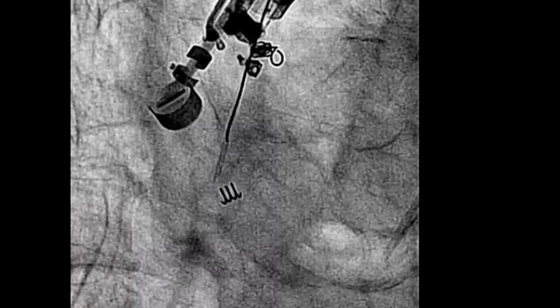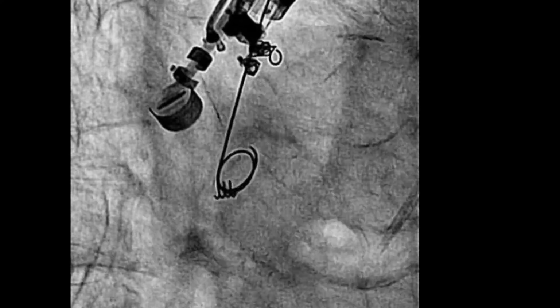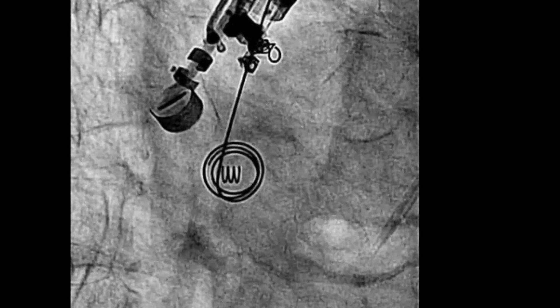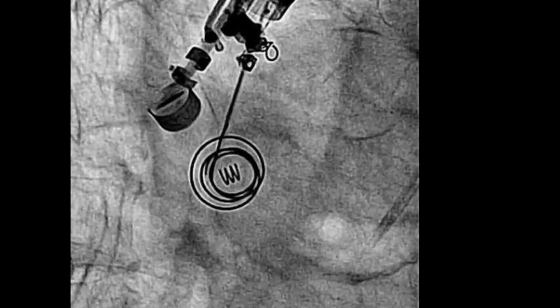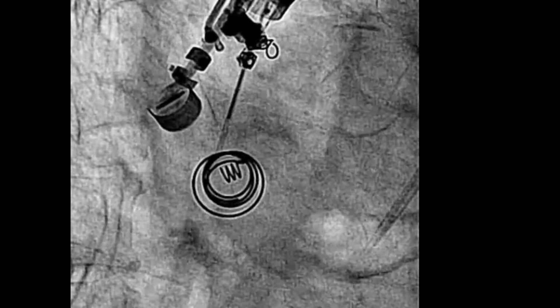Now you can gently advance, and you can appreciate the same under the fluoro. It forms 4 to 5 loops of loop diameter 20 mm. As I measured, it may take 4 to 5 coils.